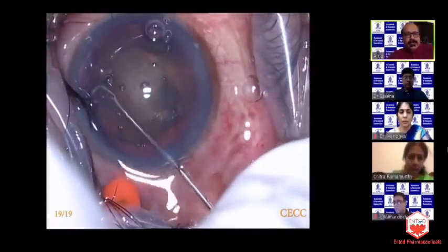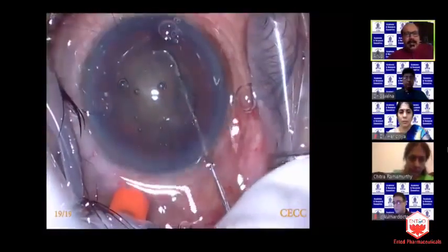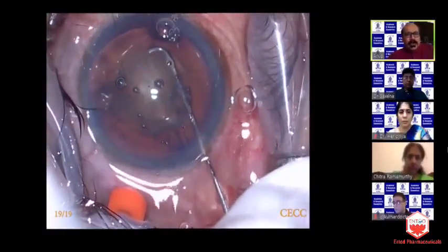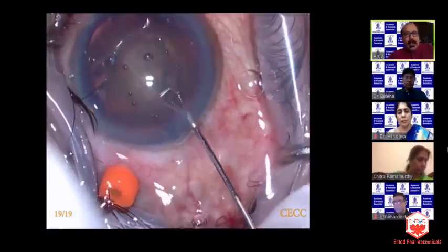All the differential diagnoses should be in the back of your mind, and you should have a decision tree ready: plan A, plan B, plan C, and everything should be a knee-jerk. You should do the right thing at the right time. So is it a patient of suprachoroidal hemorrhage?